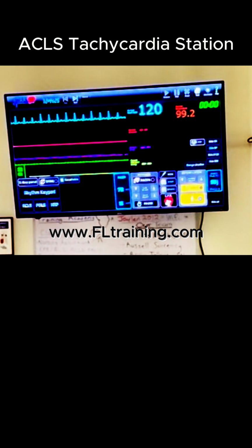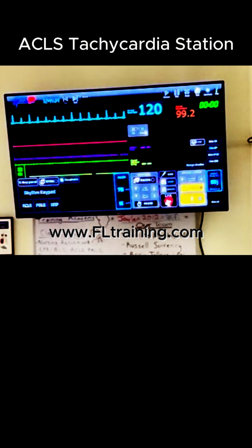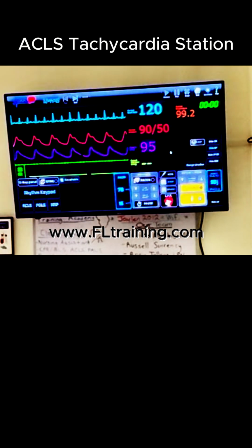Okay. I checked her. You checked her and asked, how are you feeling? And checked the blood pressure. Yes. Good job. She feels like hell because you just hit her in the chest with 50 joules. But what happened to the heart rate? Heart rate lessened to 120. So let's use good terms. Not lessened, it improved. Improved.